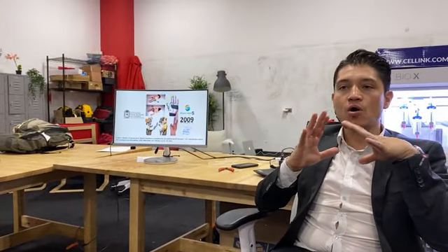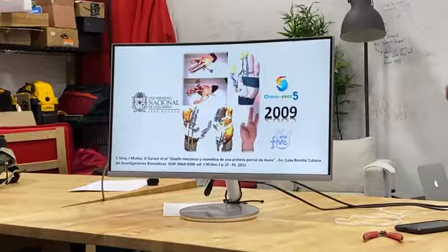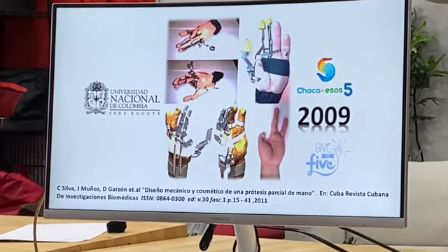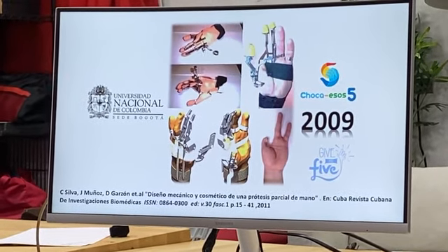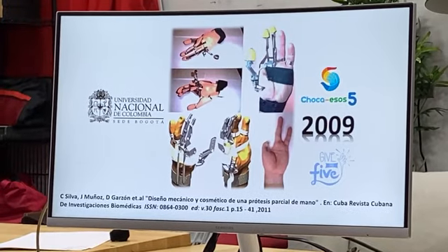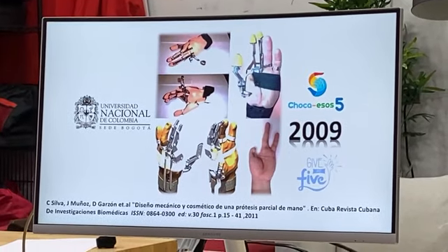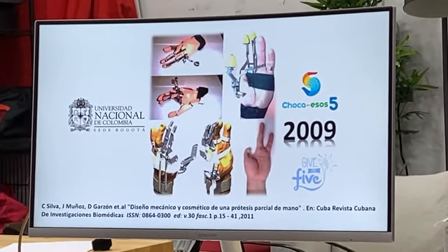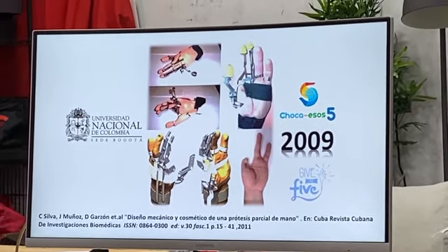Yep. So that is my dream, and I know that here are people who don't know my job, with prostheses. So I just want to show what we are doing and what we are working on right now with the 3D printed prostheses. As you know, I started to work with prostheses in 2009 with my cousin. He lost part of his hand, so I created these mechanics to bring back the movement of his fingers.